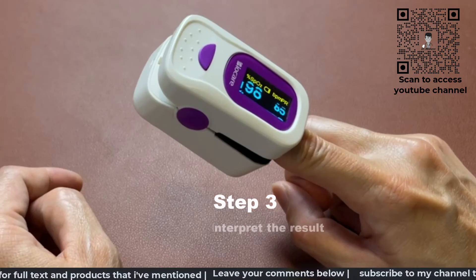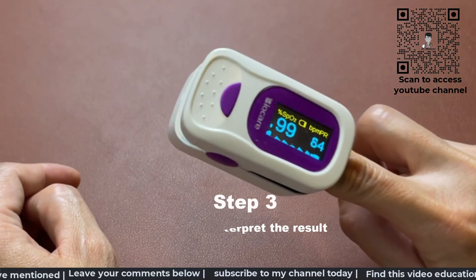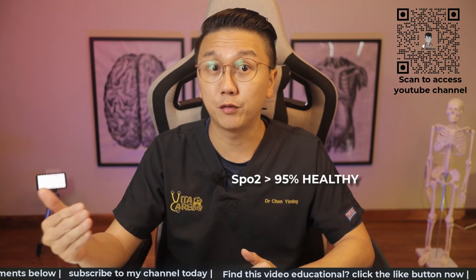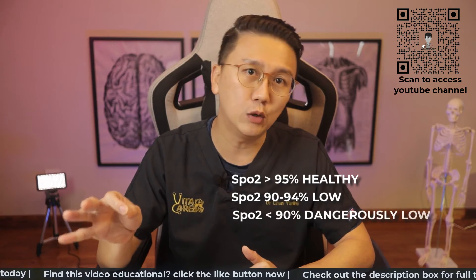Step three, interpret the results. The SpO2 tells you the blood oxygen saturation value. Healthy levels will be 95% and above. Low levels will be 90 to 94%, and anything below 90% is dangerously low.